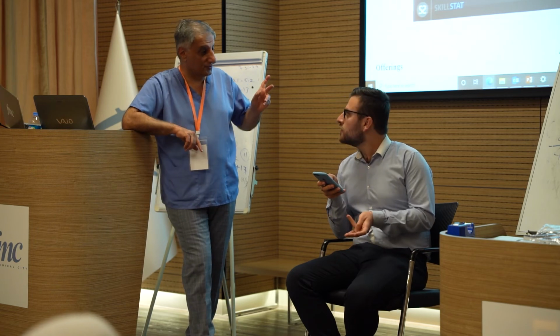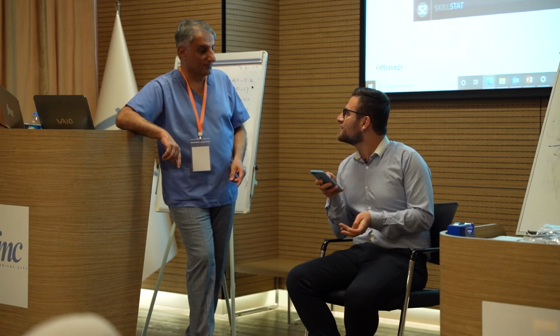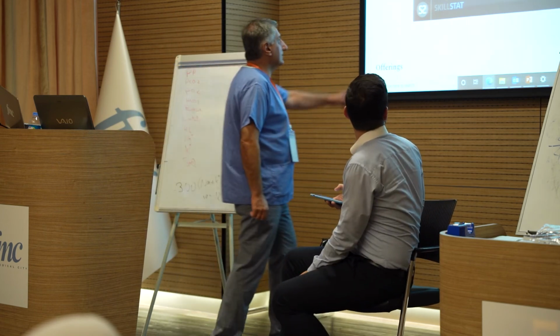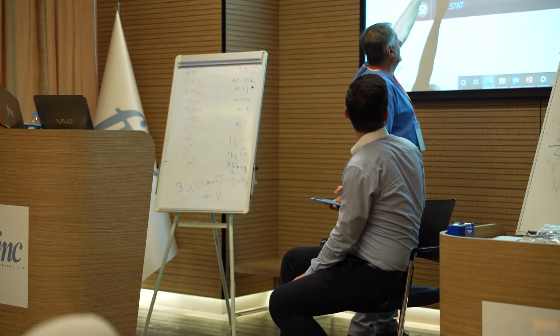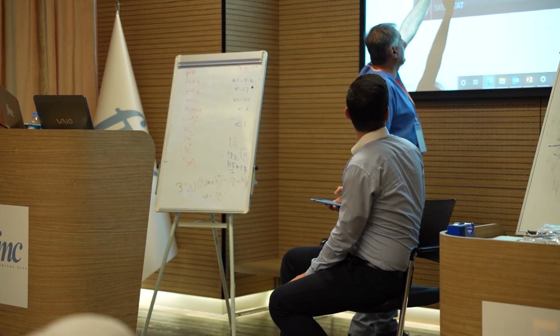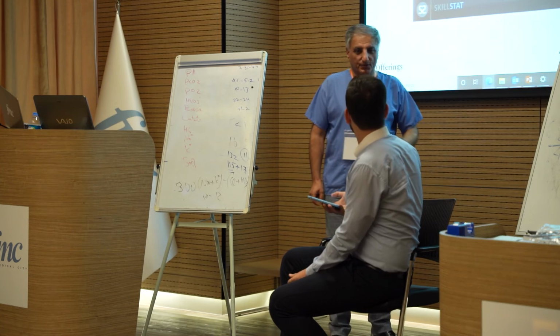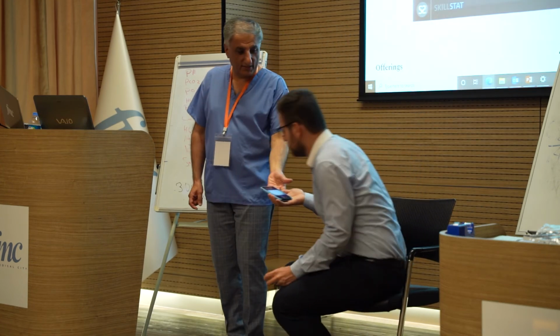That's probably difficult to see from there. Have a look at it. You can see the PR interval short, longer, even longer, and longer, and then a dropped beat. What do you call that? Wenckebach, Mobitz type 1.